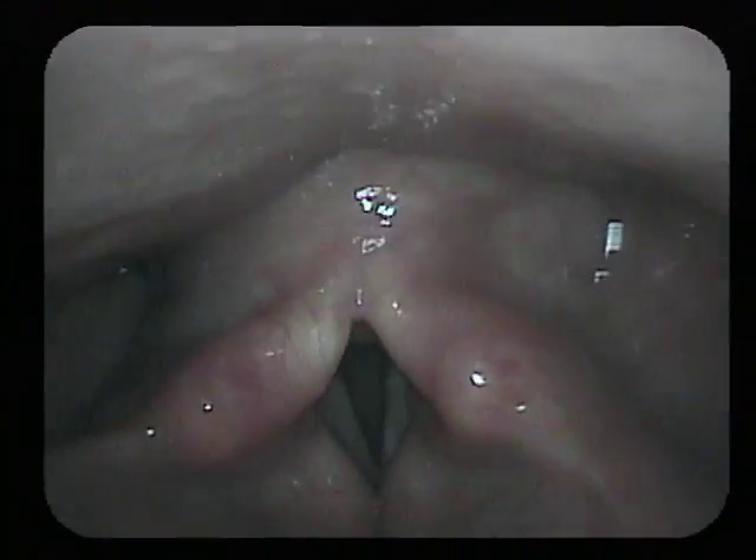So we have four ways to put about 50 cents worth of anesthetic in and get an incredibly close view of the vocal cords. Let's take a look at how close we can get.